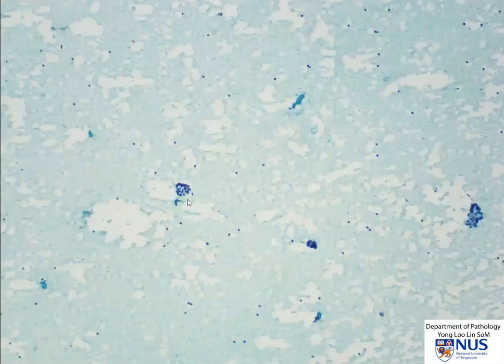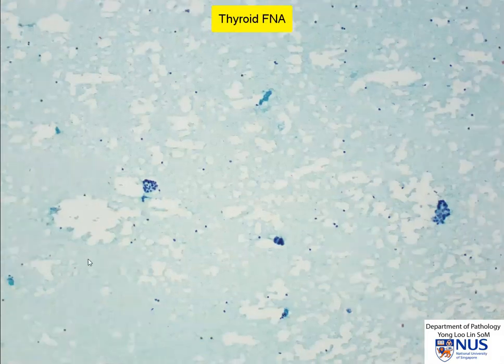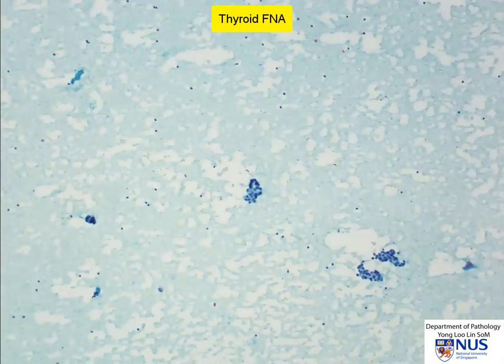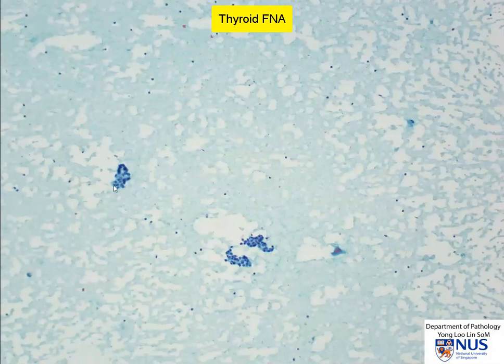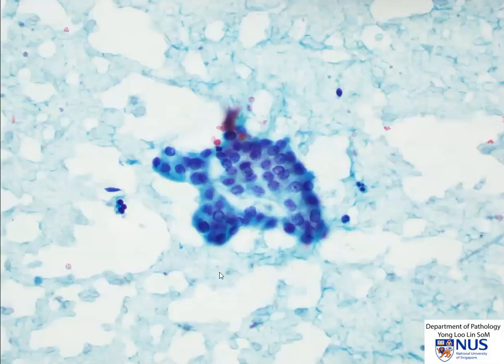Hello. We're looking at an alcohol-fixed smear taken from a thyroid nodule, and at low power magnification, we can see that there are some relatively tight clusters of cells with a hint of micro follicular formations.